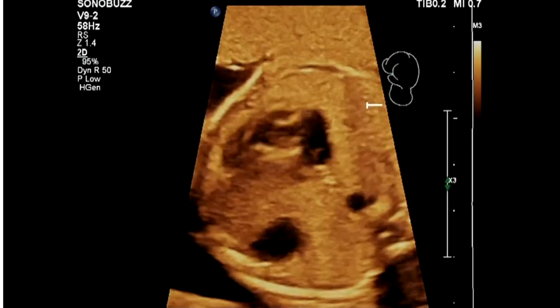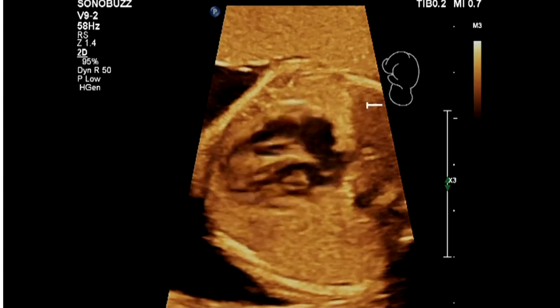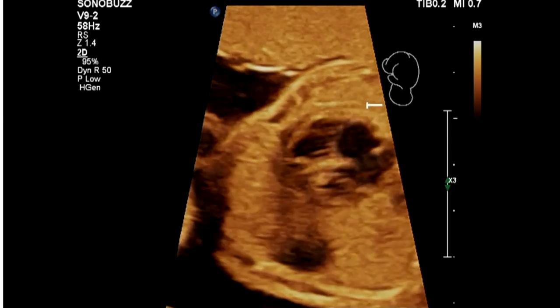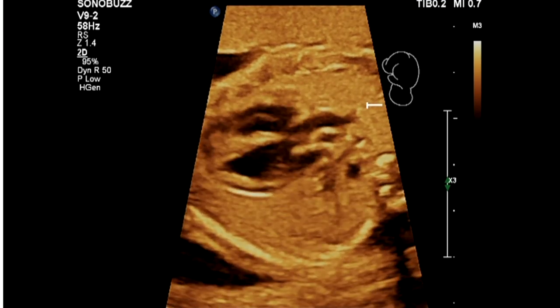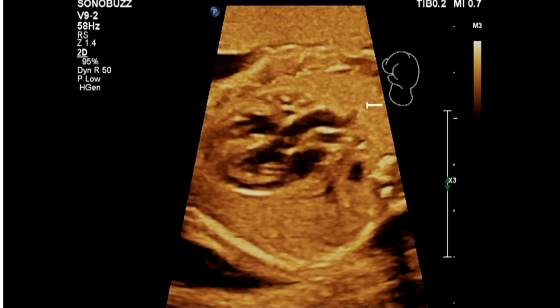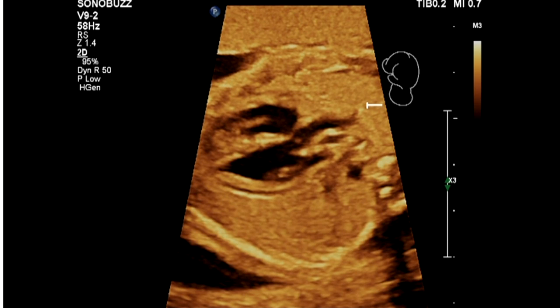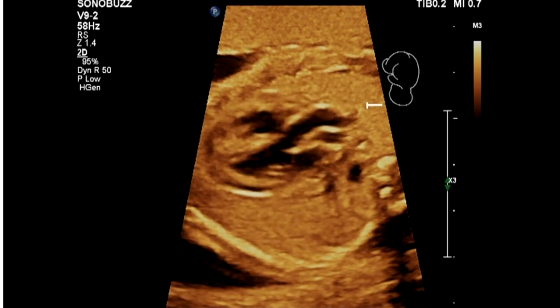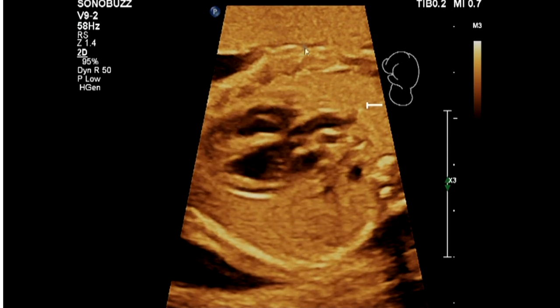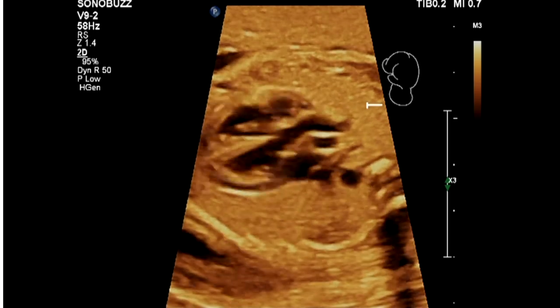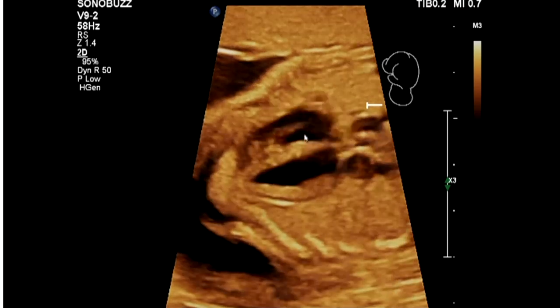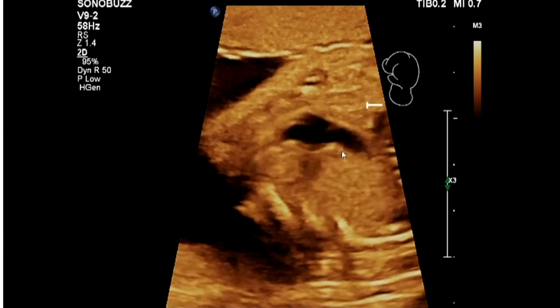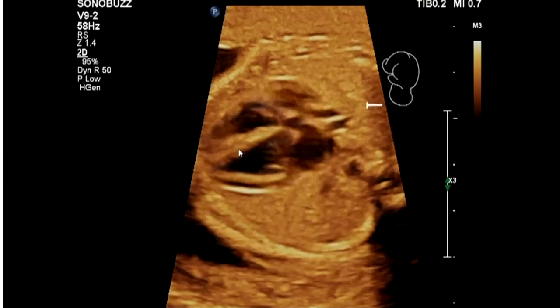Now we want to start looking at the outflow tract. I'm using two hands because I need to push a little bit — the baby is not the easiest. Gradually going from the inlet to the outlet. You can see the aortic valve — does everyone see that? This is my favorite view. Here's the septum, here's the aorta, and we're going to look at the aortic valve opening and closing — see it opens and closes, open, and it disappears during systole, then it closes. That's the aortic valve, and see the aorta going all the way up.